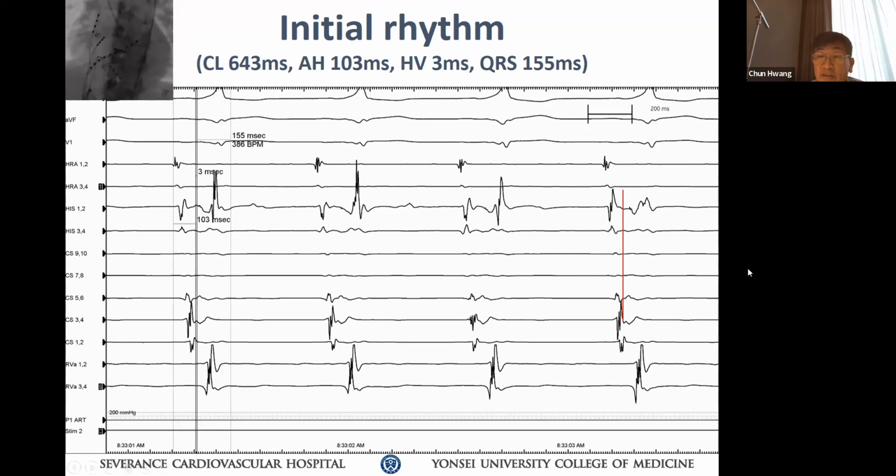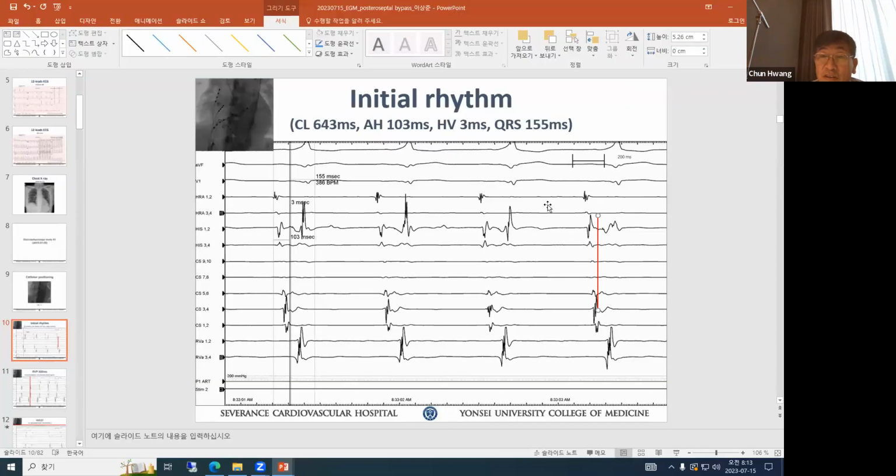Don't say that because your His is inside the delta. Go to the delta line. So on every ECG, baseline, delta, draw the line. No, not there, a little further back. A bit more, right there. Okay? The His is inside the delta wave, therefore it's not early, it's late.